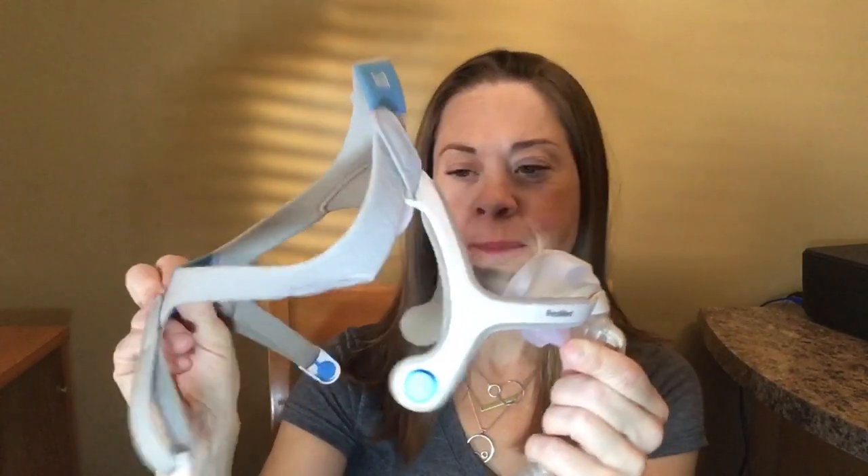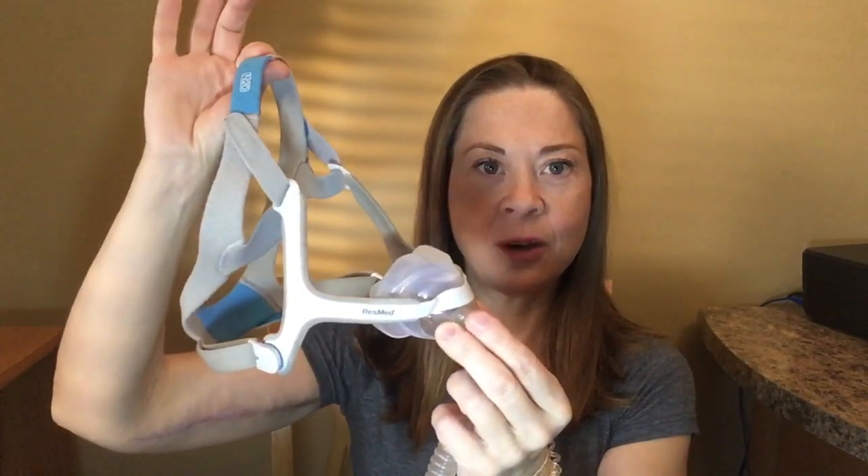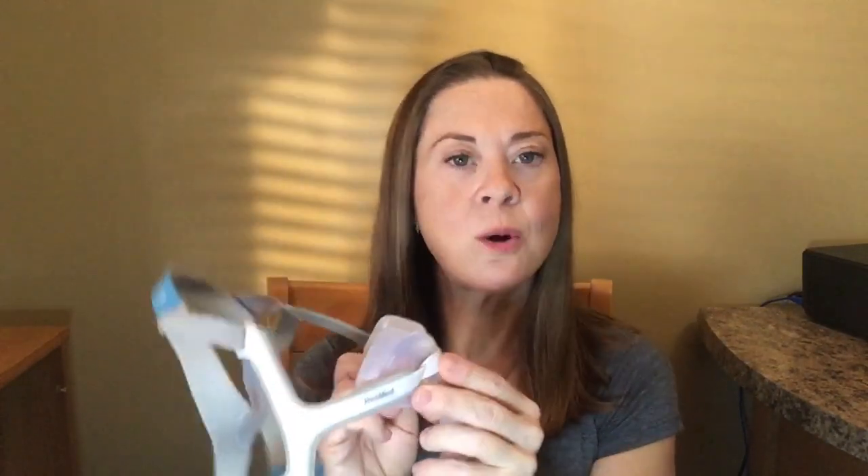This is the mask that I wear. These are the straps — they connect with magnets. Every mask involves a little piece that goes on your nose and headgear that goes on your face. This little mask also comes with an extra foot of tubing to make things a little easier, but they always involve a little piece that goes on your face and headgear.